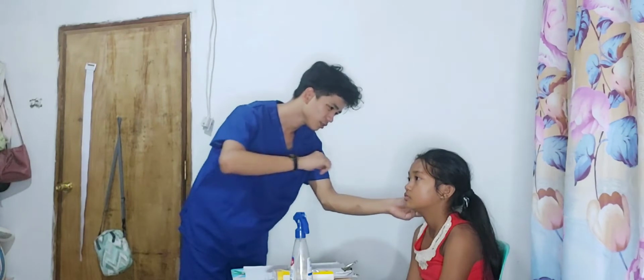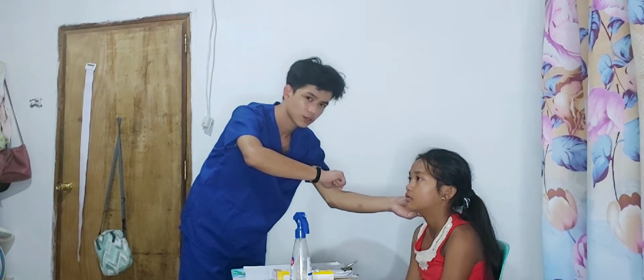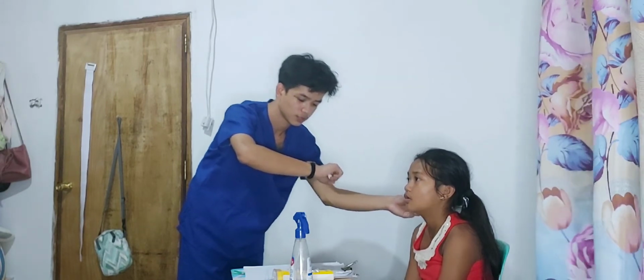Okay po. Narinig ka pa po? So we're going to count the duration. May narinig ka pa po? Wala. Wala na po. Okay, so note the time that we've gathered to the patient's mastoid. And also yung kabila naman.